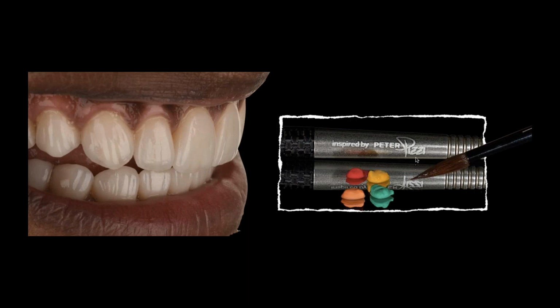All right, thanks. So a couple of questions on halo effects. Do you use a porcelain or a stain to create your halos? I use porcelain. I don't often stain for halo. And the only thing I would add to the question, 2 things. One, I know when I'm giving courses and hands-on, we address this a lot. So a few of you probably heard me talk about this before, but the halo is not the incisal edge of a tooth.